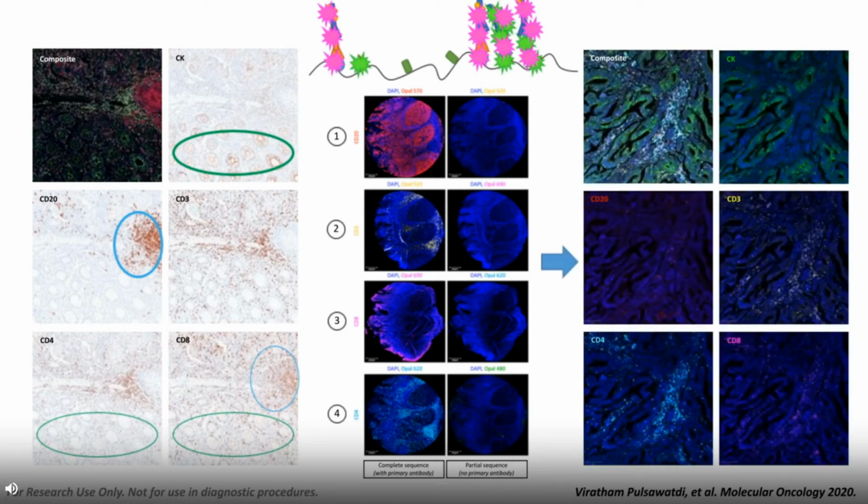The reason why it's so important to consider all these is this is only the wet lab validation, and by using an automated system, we can control a lot of additional factors through using commercial reagents or by having the system using specific times and heat settings. This means it's simpler for us to optimize by just changing small factors like the antibody concentration or the antibody opal pairings, or even the order of staining.